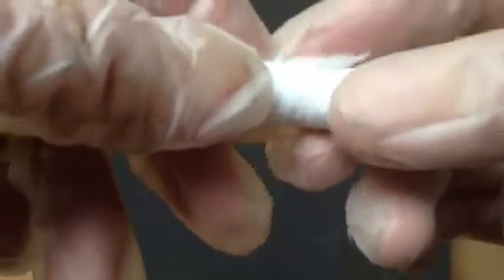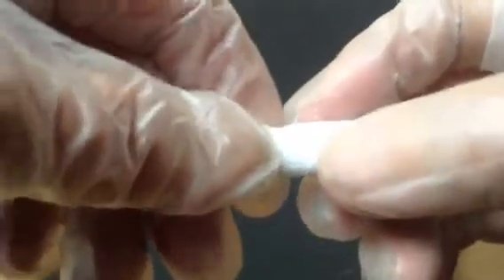We want to get the right length so that it'll end up wrapping around the bone no more than two times. I'm starting it around the bone now, totally covering the fracture. And now I'm overlapping the cellulose over the first layer of cellulose.